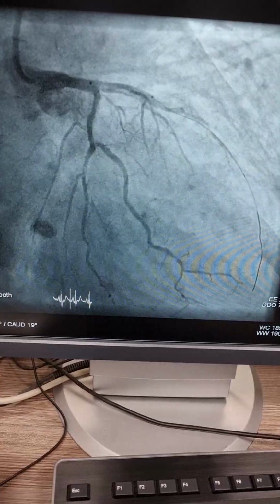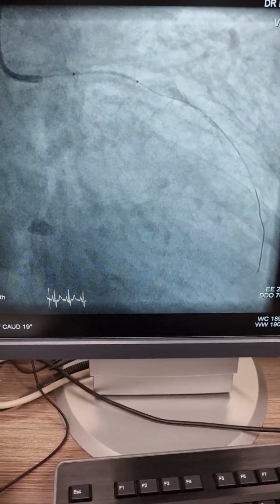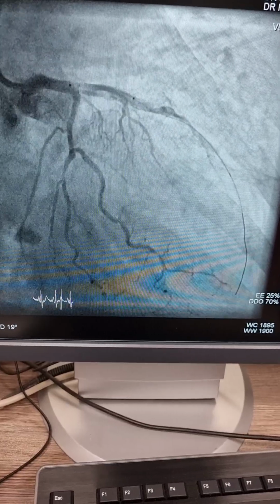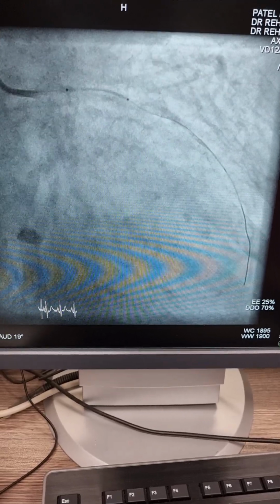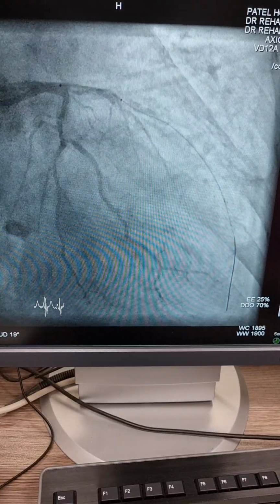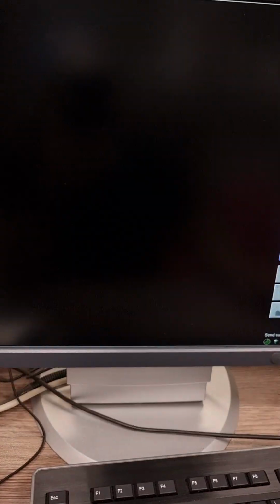Tried to put in a stent, it wouldn't go down, so I finally decided to first of all stent the ostium and the proximal segment, which in normal circumstances is absolutely an absurd idea, because the distal part of the vessel should always be stented first. But in this particular scenario, in which we did not have the rota or any other OPN NC balloon or scoring balloon, I just went ahead and nailed the ostium and just tried to save the side branch, that is circ in this case, and then open the LAD first.